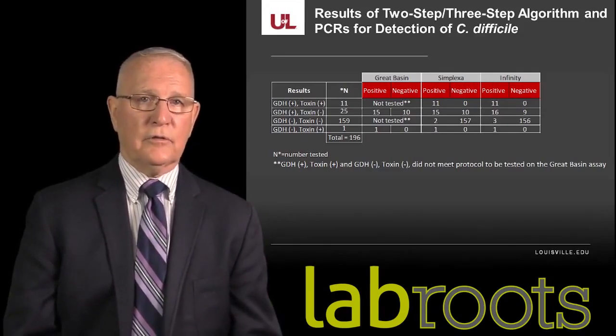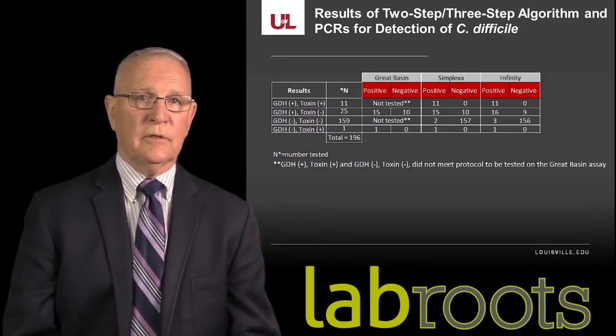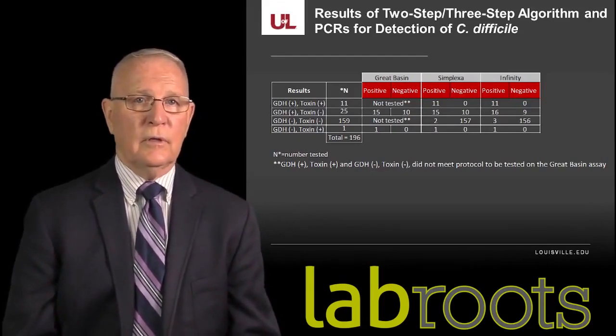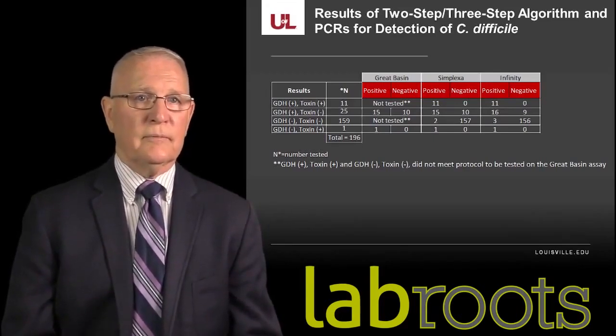Well, to answer that question, we would have had to have done either a toxigenic culture or a cell cytotoxicity neutralization assay, which we did not do. And 9 of those were negative. So the question is, was that positive a true positive or a false positive?